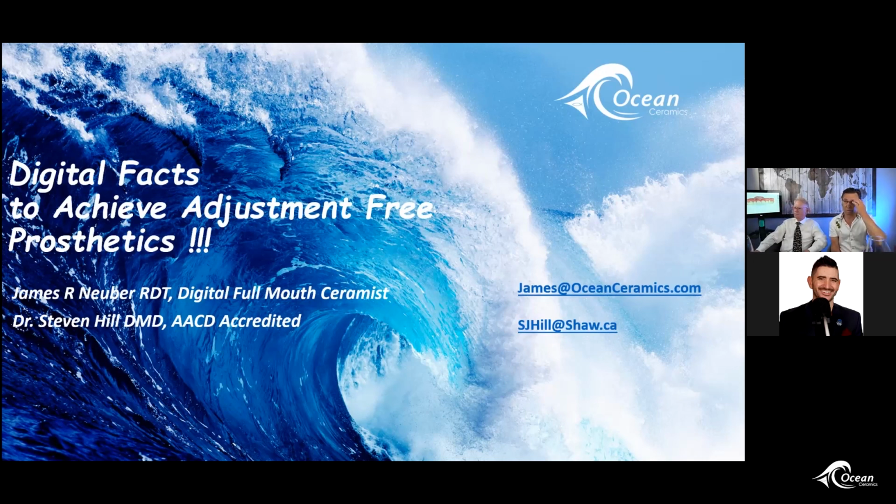Do PVS impressions with putty or heavy body make a difference? Any studies? Okay, we work with every viscosity of Honigum that Zenith DMG puts out. The shrinkage factors of all those materials, the heavy body with the light, putty with the light, the medium body with the light, they're all going to shrink 0.05%. It literally comes down to a personal preference. There's no question of accuracy with any of those viscosities. It's a personal preference, and there's no right or wrong. But the tray technique is absolutely paramount to getting the best fits.